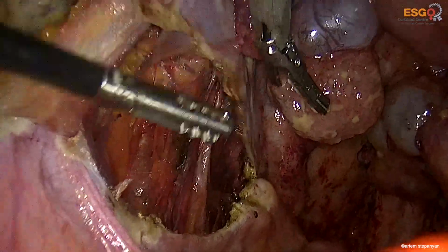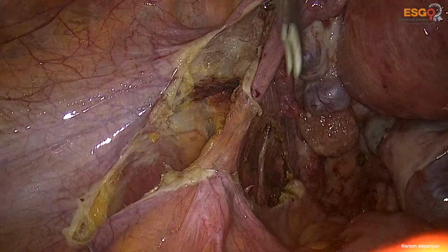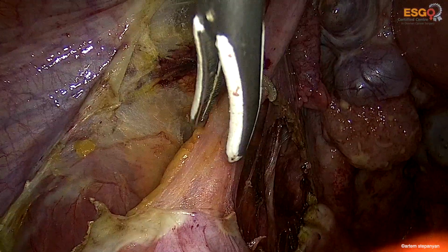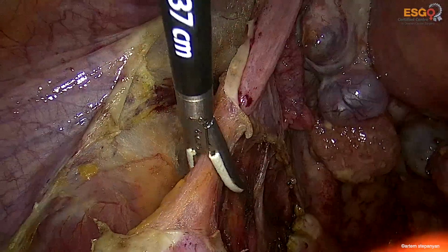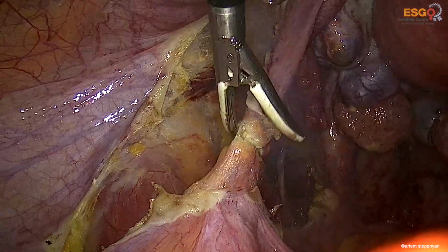It is important to keep in mind that this is a peritonectomy, and nothing except the peritoneum is to be removed during the surgery.